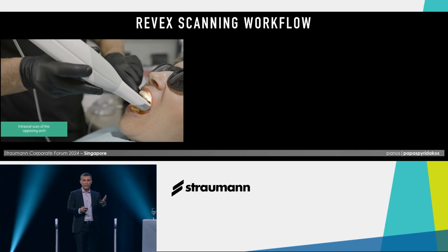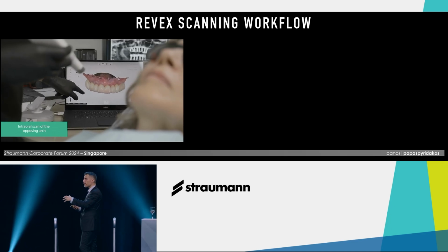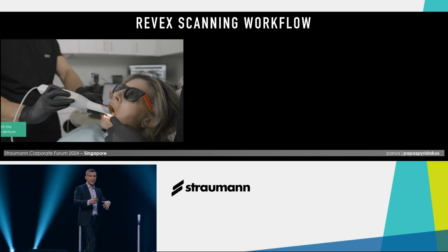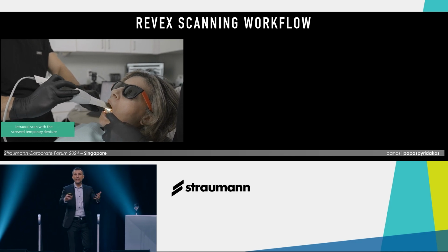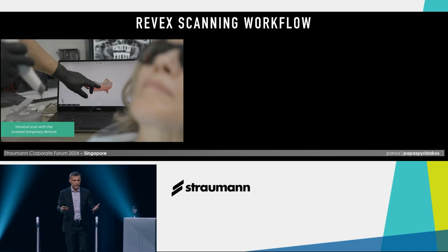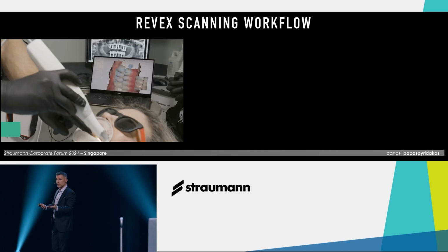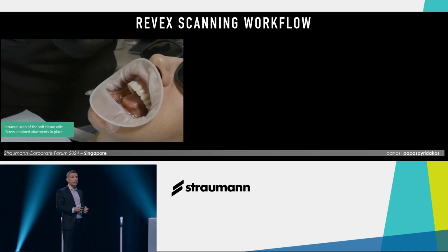How does it work? We will take our intraoral scanner, we will scan the opposing, we will scan the provisional, and we will scan the bite. These are dentate scans. Very easy to do and very efficient. Then we will take a second set of scans. We will remove the provisional, and we will scan the soft tissue.